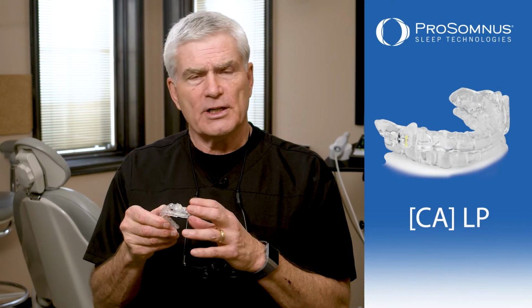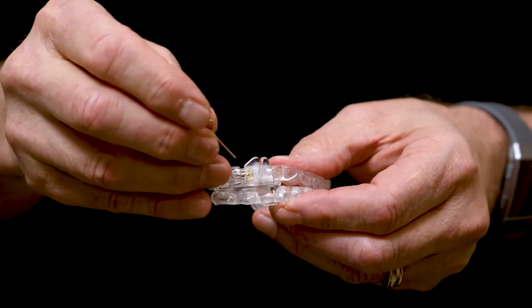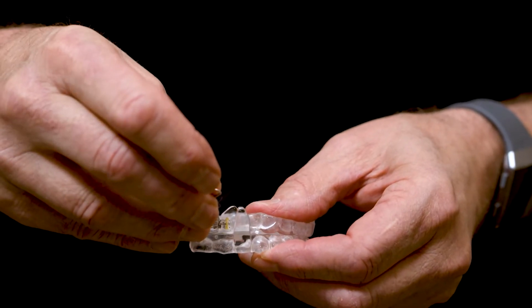Now that's different and in a little bit of contrast to the CALP. The continuous advancement low profile appliance is a dorsal-like device, a little bit smaller as you'll see, and even though it's technically a continuous advancement device, you'll see that it has a little bit of iteration twisted into it. You'll understand in a second. There's a little jack screw device on the side which has a pinhole in it.